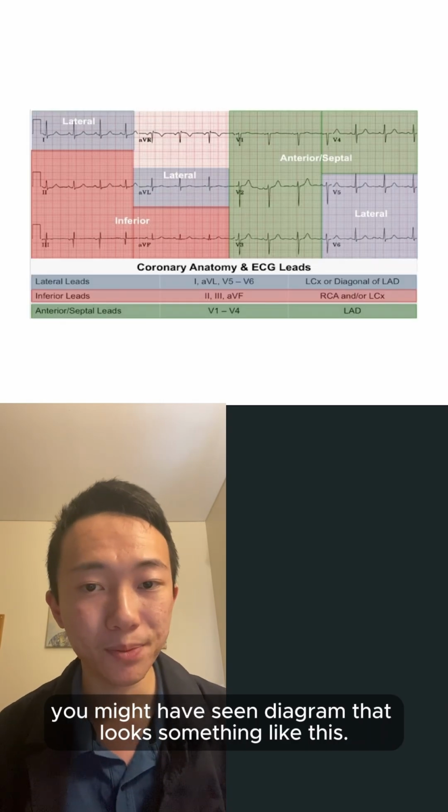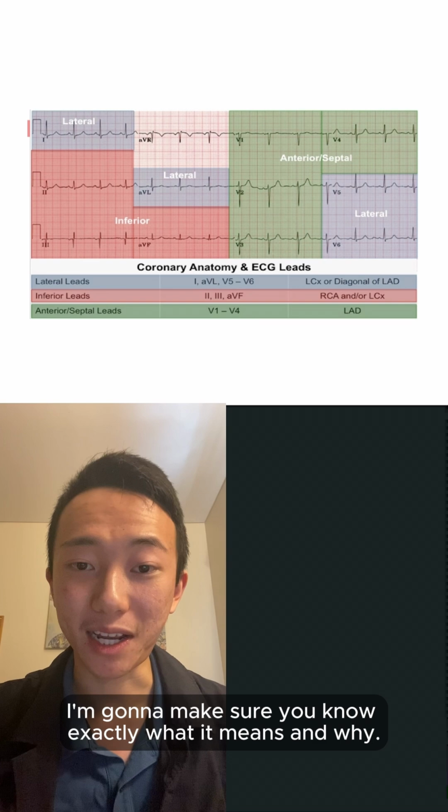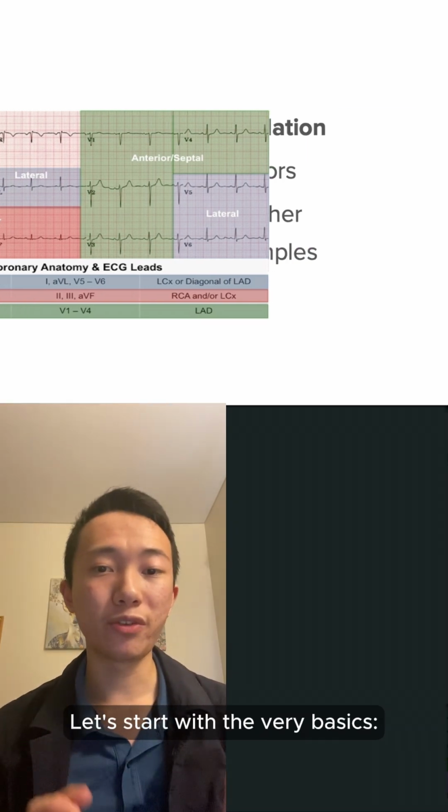When it comes to ECGs, you might have seen a diagram that looks something like this. In today's tutorial, I'm going to make sure you know exactly what it means and why. Let's start with the very basics.